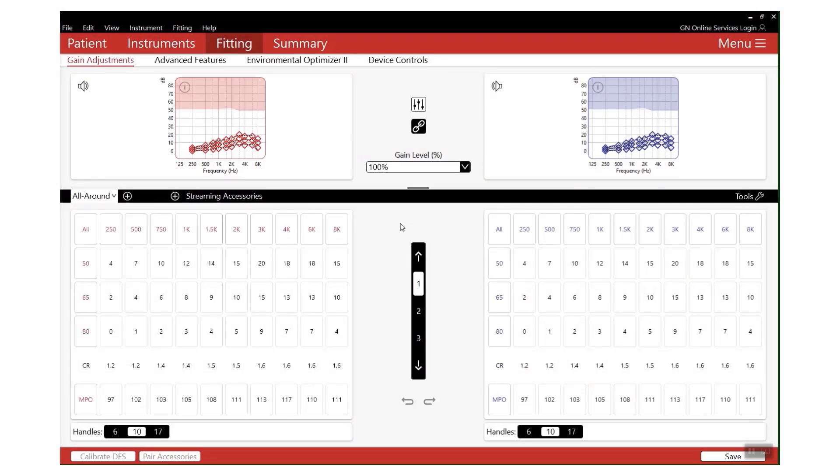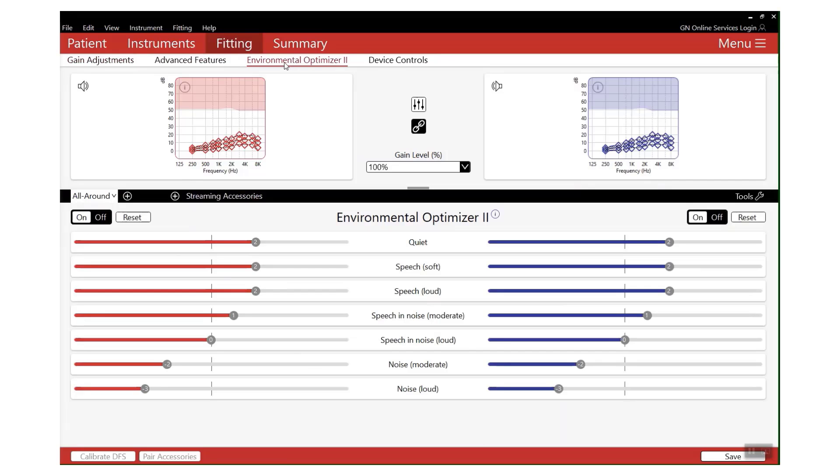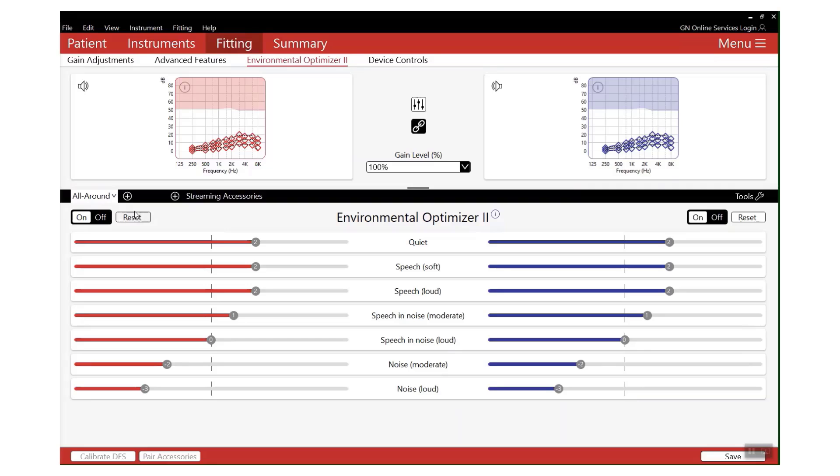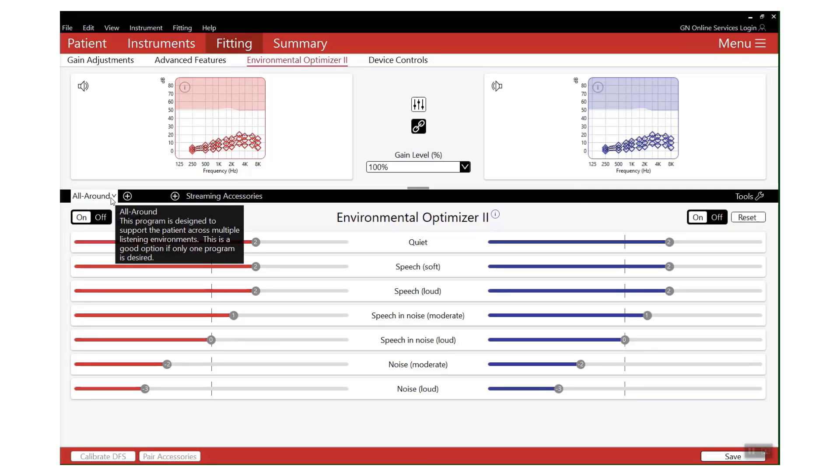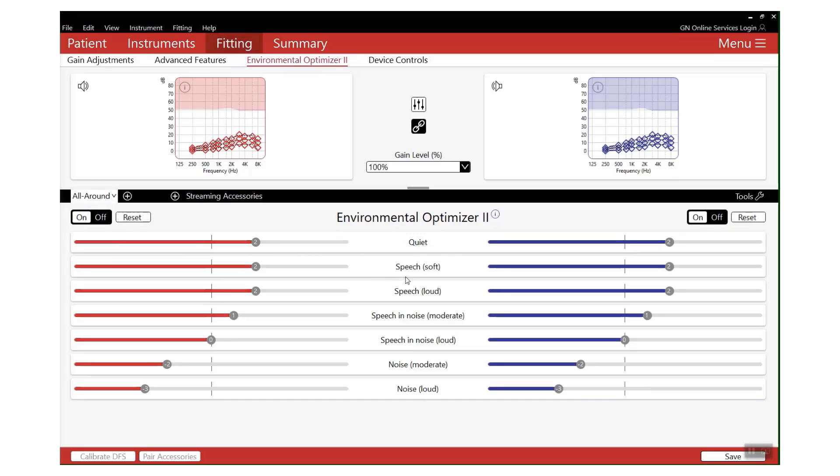Tip four: Environmental Optimizer and Environmental Optimizer 2, technology-depending. So if you find yourself fitting an Environmental Optimizer 2 - in this case as I'm connected to some Level 9 technology - you will see that there are seven different environments that the hearing aids can classify into. So though we may only have one static all-around program, the hearing aids are constantly analyzing their surroundings, classifying between these seven environments and adjusting themselves accordingly.